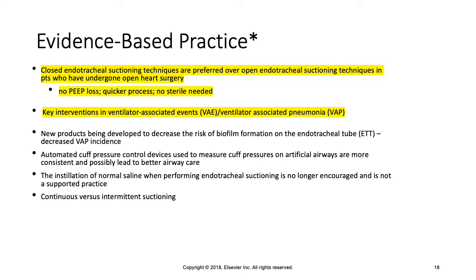And we'll talk about the fact that there's been some changes in the thought of how to suction. If we will suction continuously while removing the suction catheter, or if intermittent suction is recommended. So your book, I think the updated version of your book comes out sometime next week, the next edition. In this edition, it recommends intermittent suctioning.